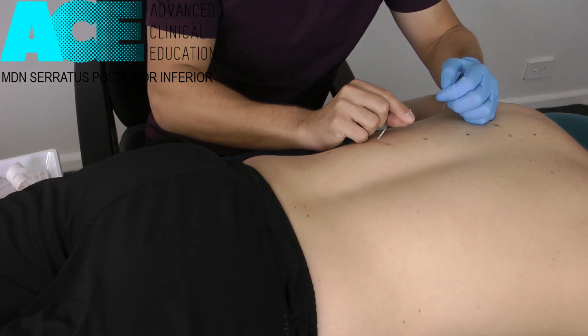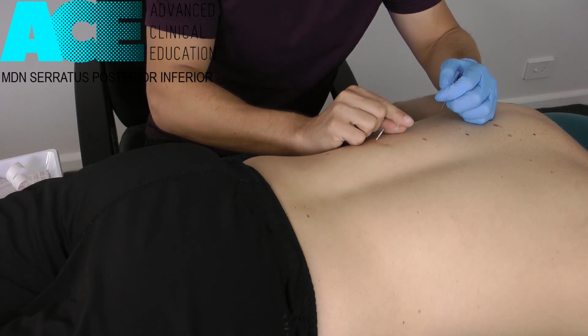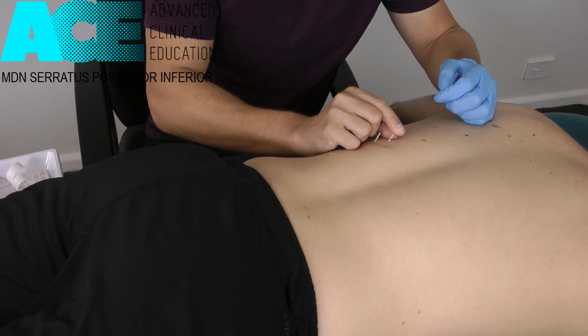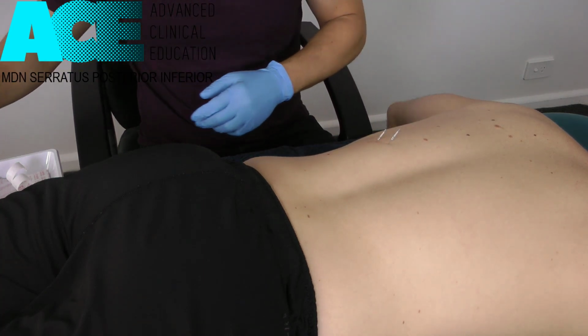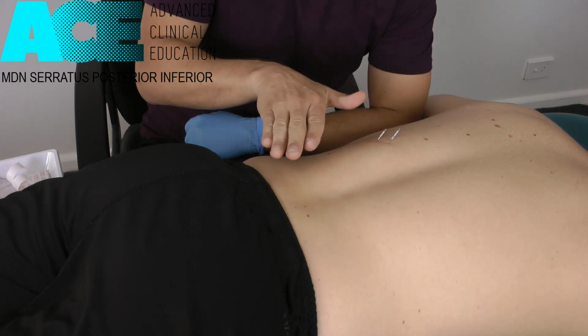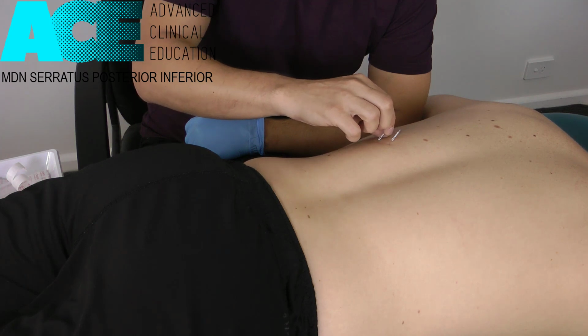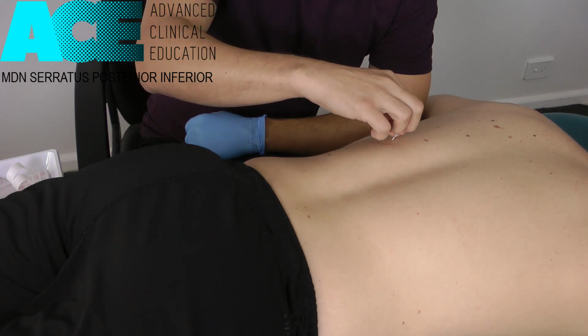Again, staying superficial to the ribs. We've got plenty of space to play with here, angling down and away from the lungs towards the lumbar spine. It's a fairly flat muscle, and once we've threaded the muscle in this way with the needles, we can actually use a winding technique to wrap that myofascial tissue around the needle and get a nice stretch.